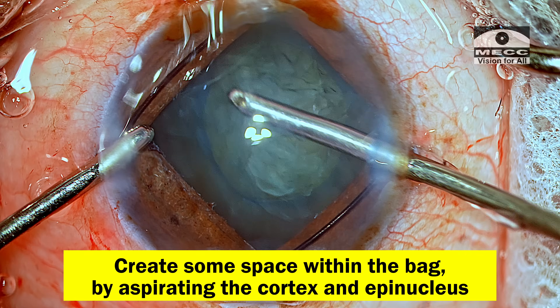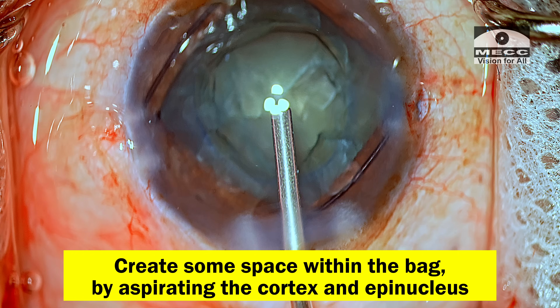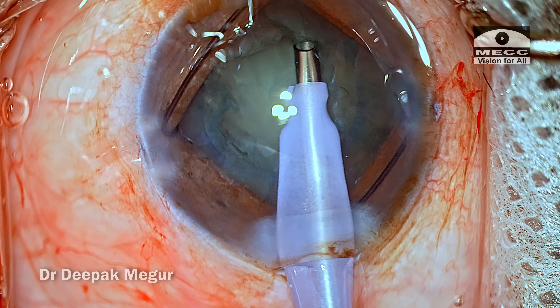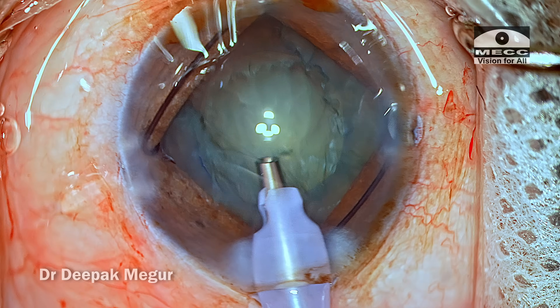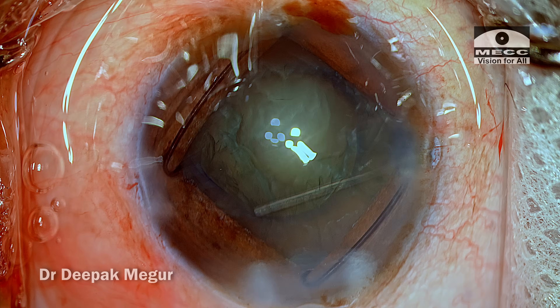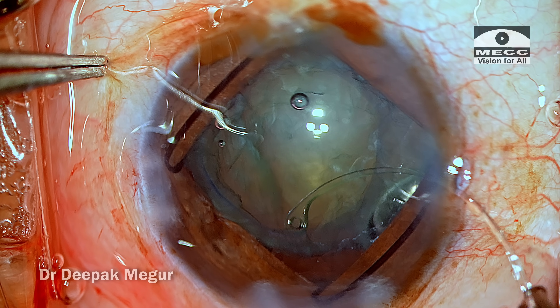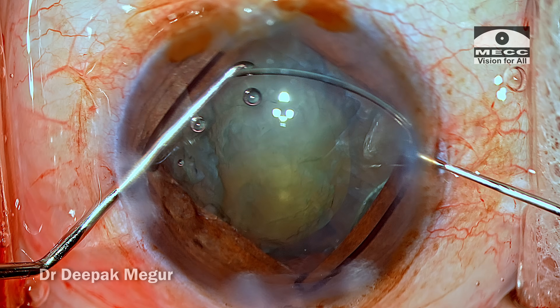The cortex is aspirated out, but the epinucleus still seems to be there. So at this time I go in with my phaco probe in epinucleus mode to debulk some of the nucleus and epinucleus, especially around the edges of the rhexis margin. This would help me navigate the CTR much more easily and also ensure that less cortex is entrapped later when trying to strip off the cortex. One more tip before introducing the CTR: inject some OVD under the anterior capsule. This will separate the cortex sticking onto the capsule and create space to negotiate the ring under the rhexis margin.